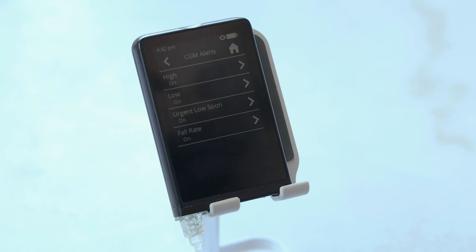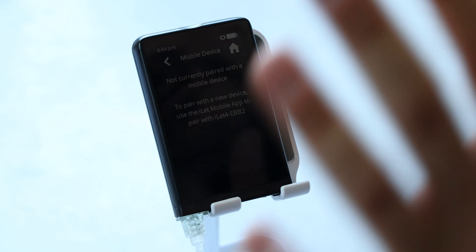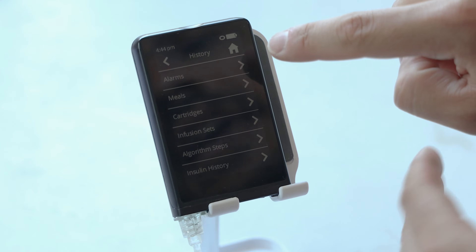You can also go into CGM alerts and adjust your CGM alerts. There's a phone icon because there is a phone app — there will be one on iPhone and Android upon launch. I don't have that right now, but as soon as I do, I'll show you. You can change the volume of the device from high all the way to low, even off. Then there's the history icon, which shows you the history of alarms, meals, and infusion sets. You can even show your endocrinologist or diabetes educator that information, and all of it wirelessly transfers to the smartphone app for you and your care team.